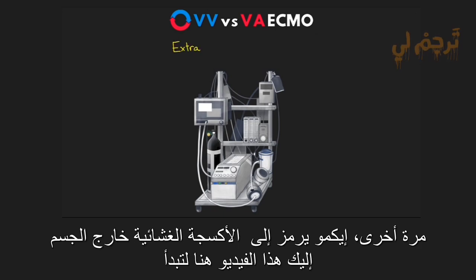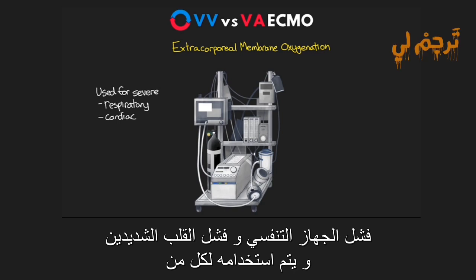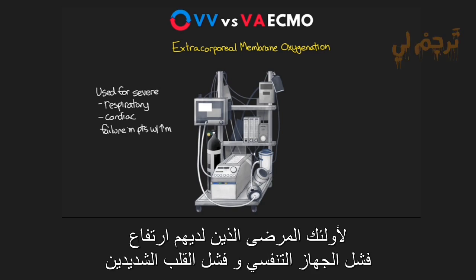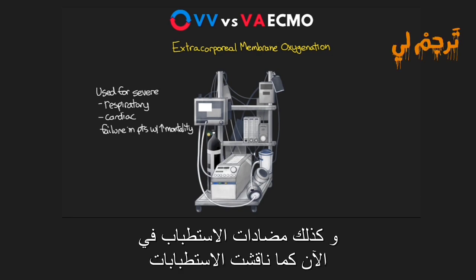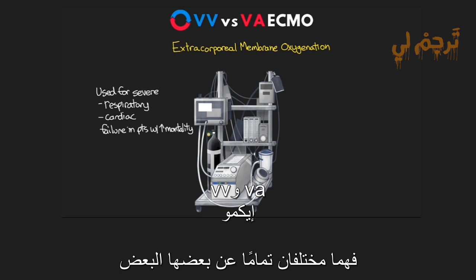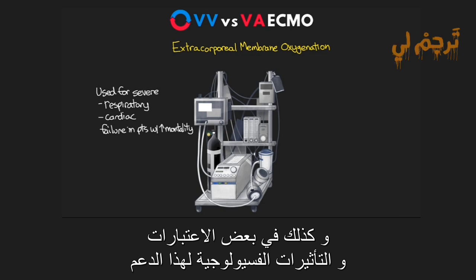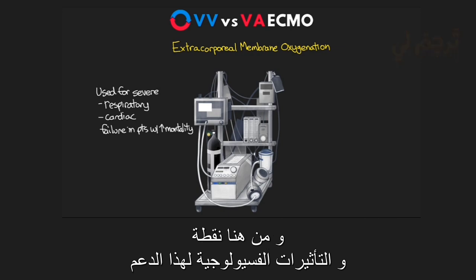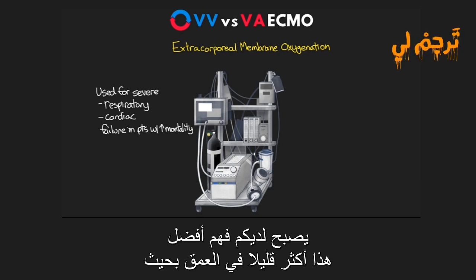So to start off, again, ECMO stands for extracorporeal membrane oxygenation, and it's used for both severe respiratory as well as cardiac failure for those patients that have a high expected mortality. Now, I did discuss the indications as well as the contraindications in that previous lesson, and while very similar in many ways, VV and VA ECMO are also quite different from one another, from how they provide support to the patient, as well as some of the considerations and physiological effects of that support. And hence the point of this lesson is to be able to go over this a little bit more in depth so that you guys have a better understanding of this.